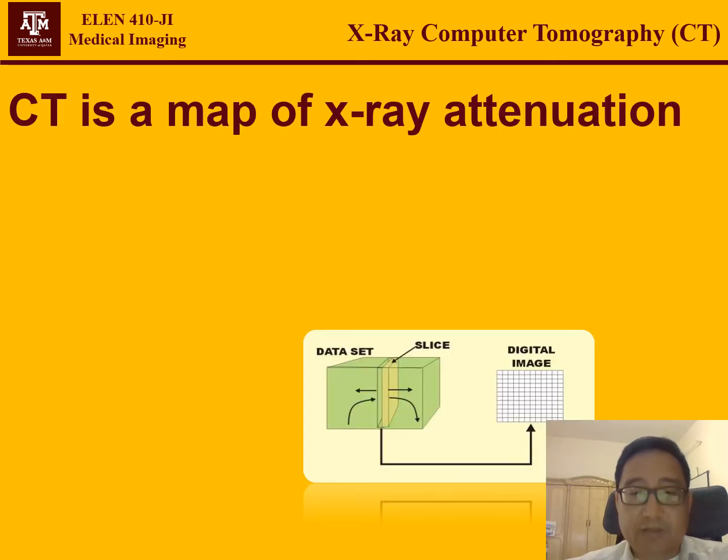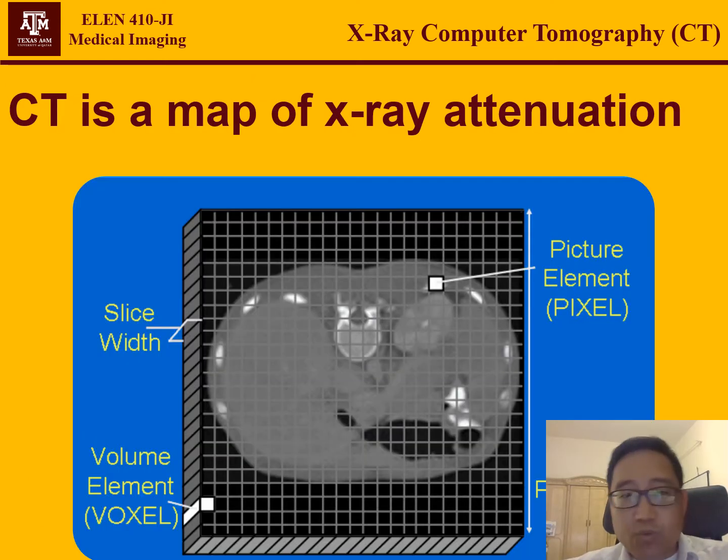parts of it. Okay, so when you see a CT image, you wonder what all this brightness and darkness actually means. Let me start by telling you these are actually a map of X-ray attenuation of the organs. The images we see consist of many little dots.